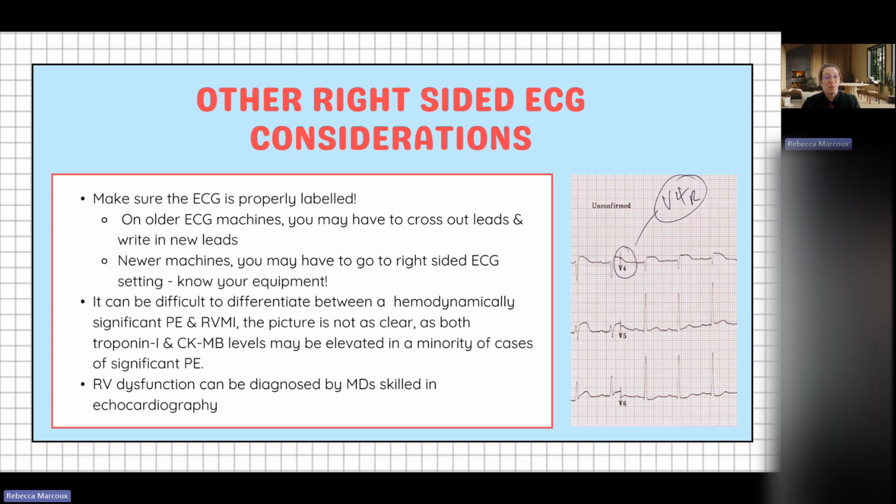That's the other thing. We can set the machine up, but if we don't put the leads as the machine is expecting, then it's not going to be right on the printout. So make sure you know your machines.